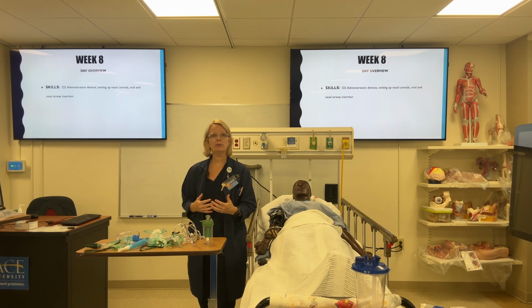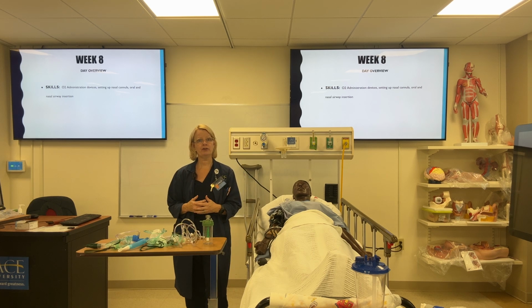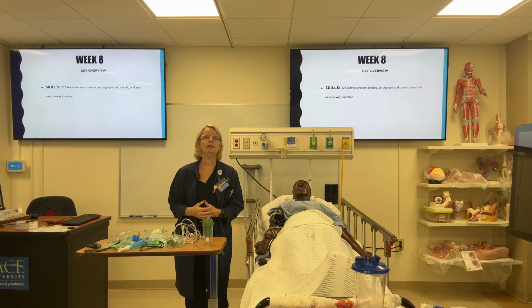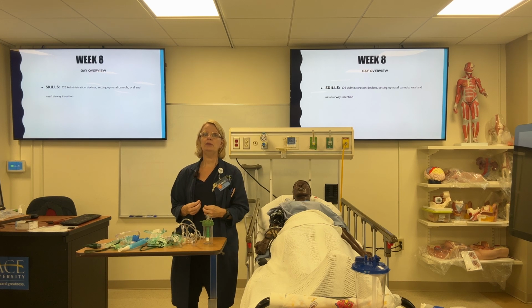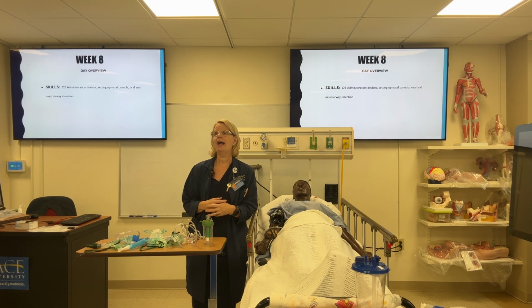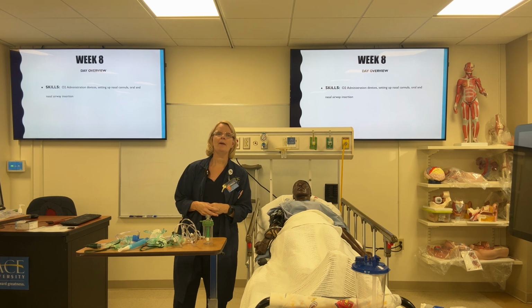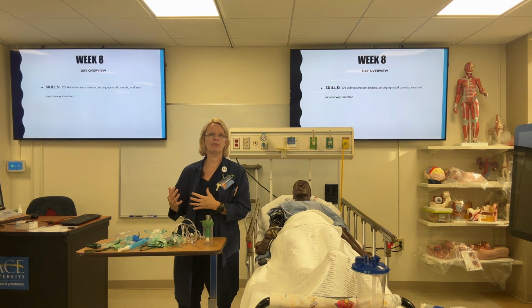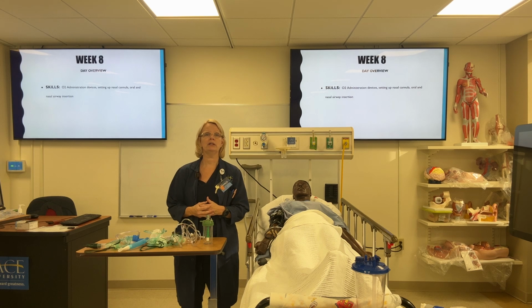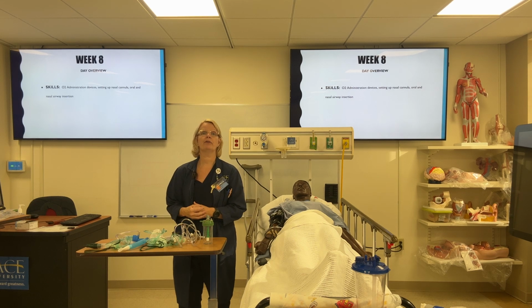So the first thing we're going to be talking about is oxygenation. You're going to find that a lot of your patients are going to, at some point, need to be put on oxygen. One of the first things that always comes up is, do you need a doctor's order to put somebody on oxygen? The answer is yes, you do need a doctor's order, but does that mean that you let somebody struggle who's not breathing very well, whose O2 sat is really low, and not put them on oxygen first because you're waiting to call the provider?